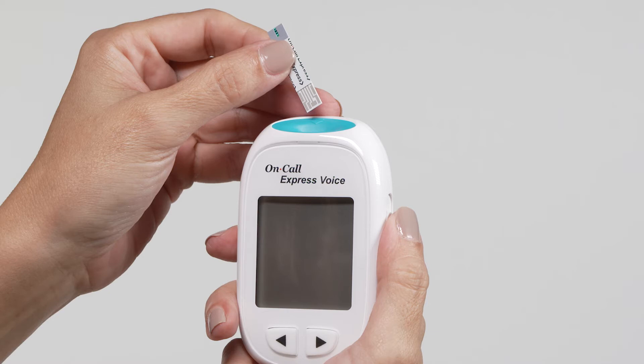Insert a test strip into the strip port, contact bars end first and facing up. Insertion of a new test strip at any time will cause the meter to automatically enter the test mode.